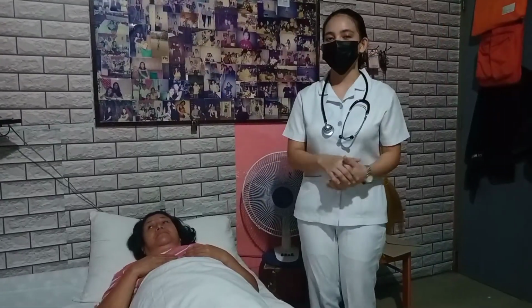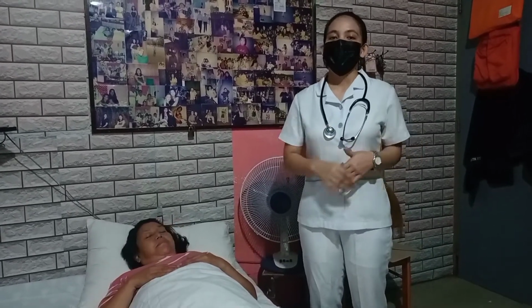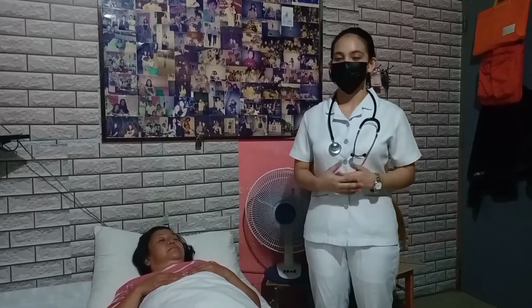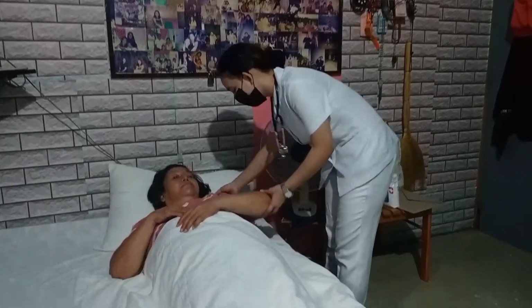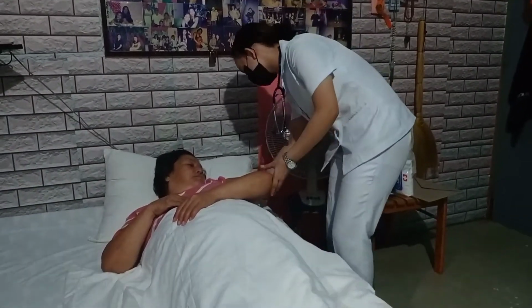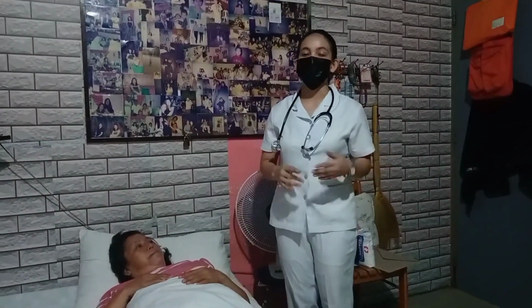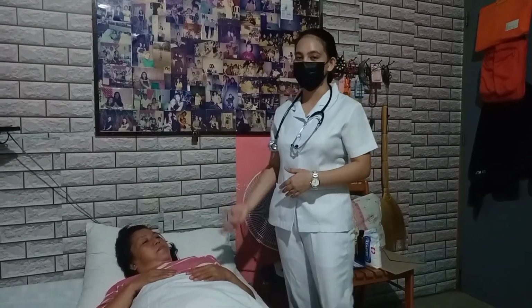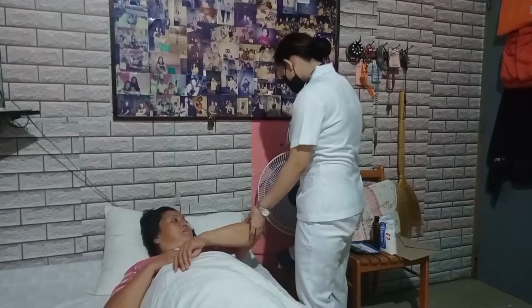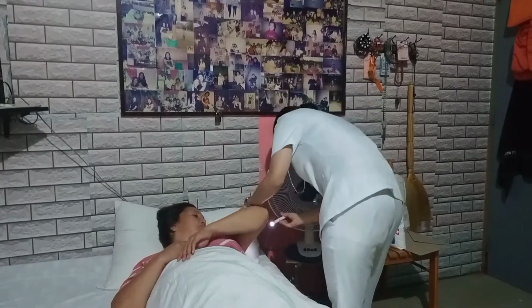The next step that I'm going to do is decide which part of the patient I'm going to inject. As mentioned earlier, I'm going to do a subcutaneous injection. So I will expose the area where I could perform the procedure. This is the subcutaneous area, ma'am. And now I'm going to check if there is any inflammation or tenderness regarding the skin or the subcutaneous part of my patient. So now I'm going to check if there is any discoloration or inflammation on your skin before doing the procedure.